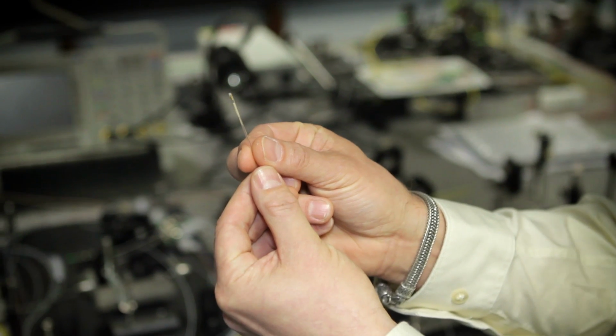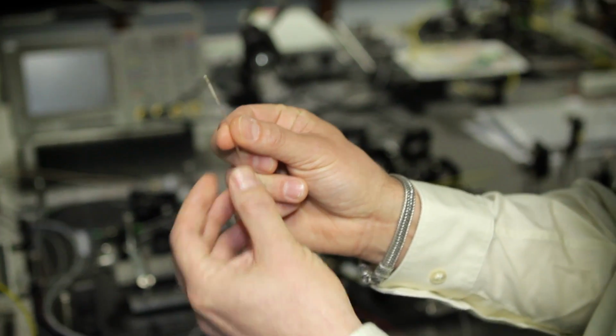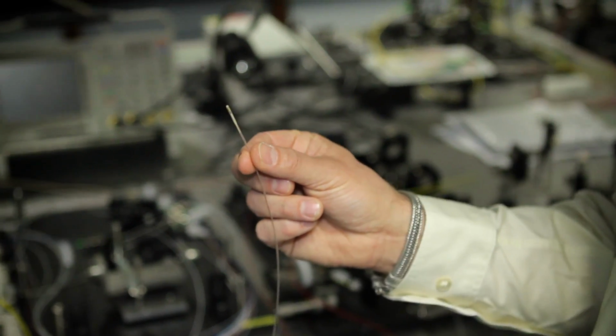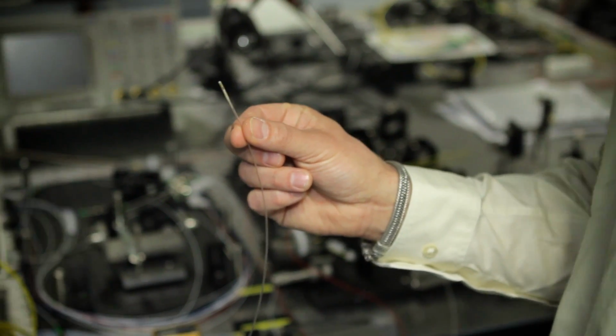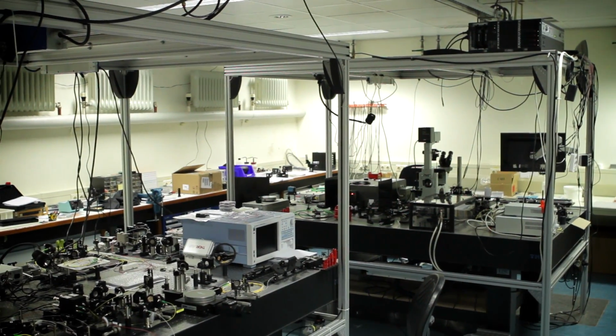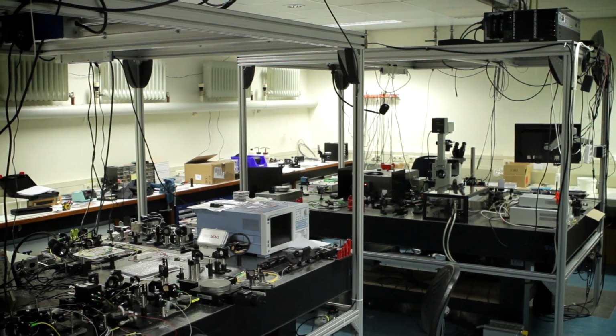This is an endoscope. We need it to be very small to reach the very small areas of the lung. So the lung starts pretty large, about this size, but it comes down to the size of less than 1 millimeter. So with this one we can't even reach the furthest areas of the lung, but we can reach about 90% of it. And this is what you want to use to look for abnormalities, for instance lung cancer.